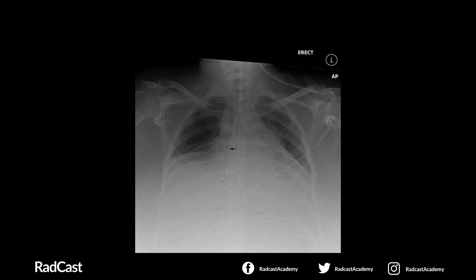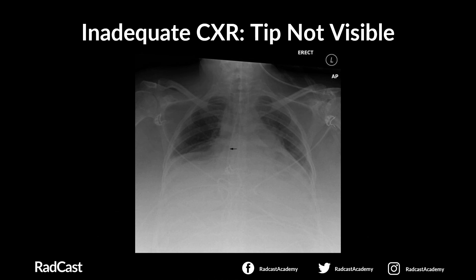For the final chest x-ray, after confirming patient details and checking the viewing field showing the upper oesophagus and extending beyond the diaphragm: following the five steps, the NG is descending in the midline, but from there we get lost. We cannot see whether it bisects the carina, whether it passes through the midline of the diaphragm, or whether the tip is below the left hemidiaphragm — the tip is completely obscured. The x-ray is very hazy and inadequate, so it would not be safe to use the NG based on this image.